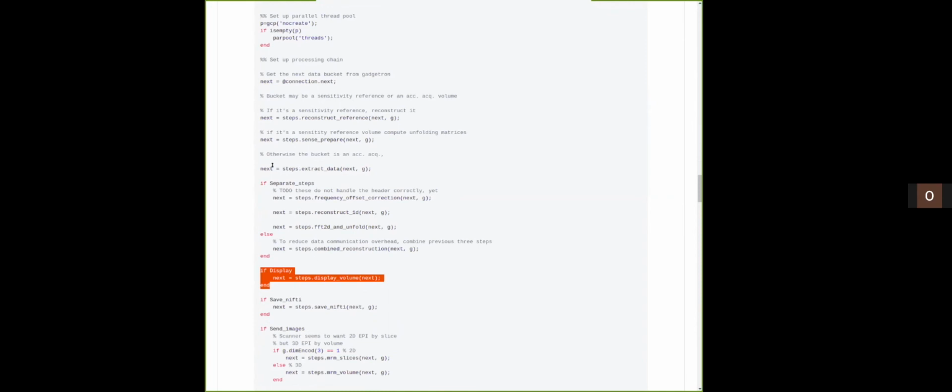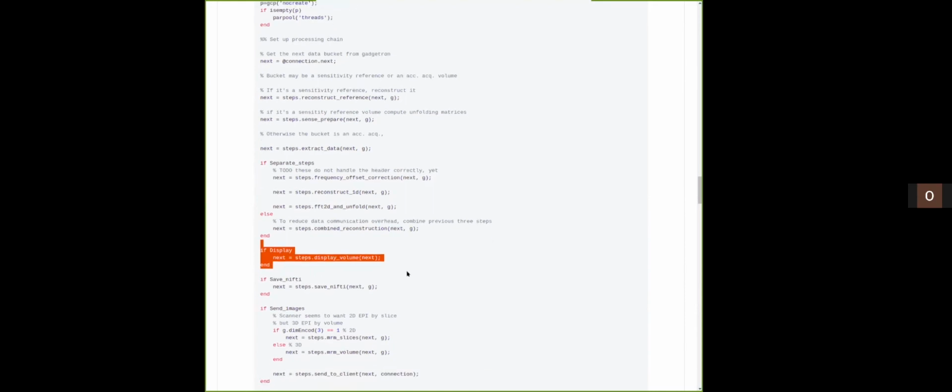So I'm using this function composition, functional programming style that Christopher introduced. The word next there is like steps in his demo, I think, and we can have some conditional formation of the chain of the functional composition.